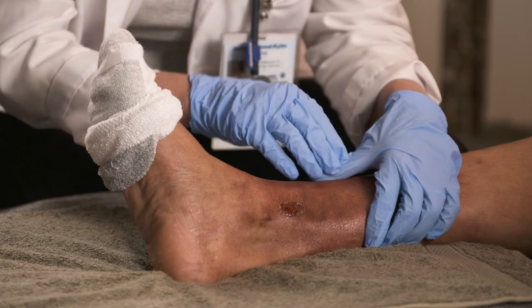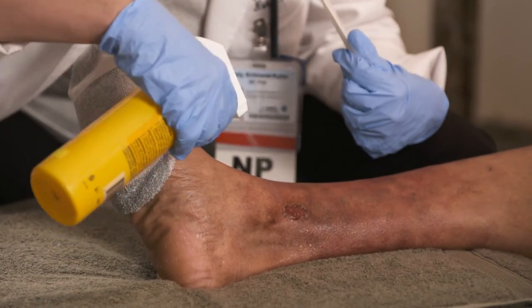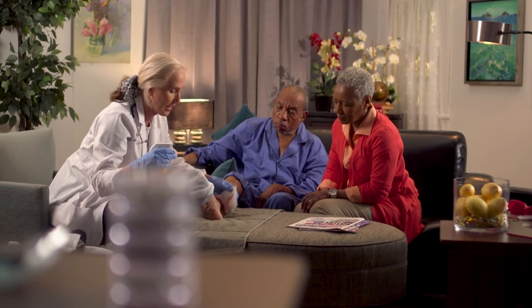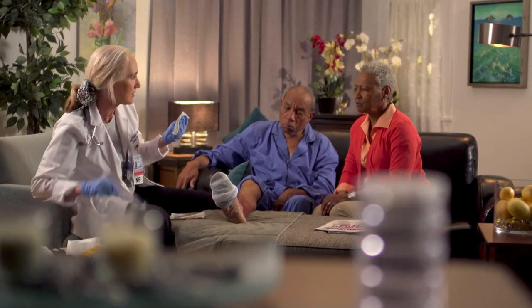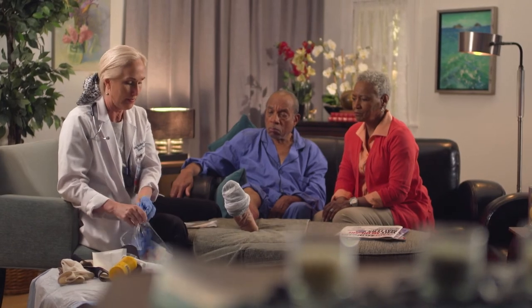So when you take off the dressing, he can go ahead and take a shower and wash it with soap and water. I'm going to use some saline spray today to show you how to do it. And then blot it. And then I have a plastic bag over here — you'll put all of his supplies in here. You can go ahead and remove your gloves as well and put them in the bag.